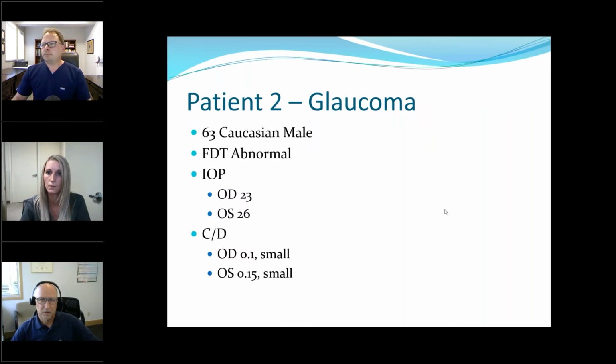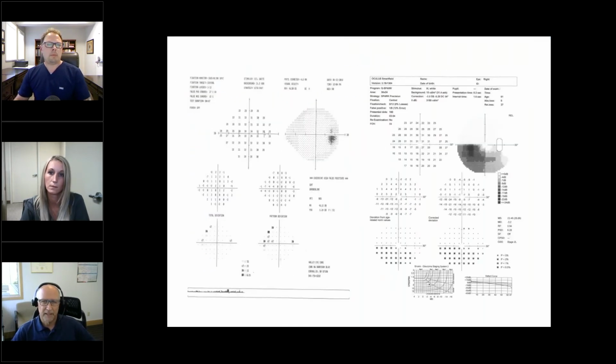Jim, just a quick question on that case, if you go back to that. It looks like the patient's numbers, the fixation losses and the false positives, were a lot better on the Smartfield test, and that in terms of the Humphrey result, the results were quite unreliable. Is that in fact what you had said about this? Was it because the standard testing time was too long, or any idea there?